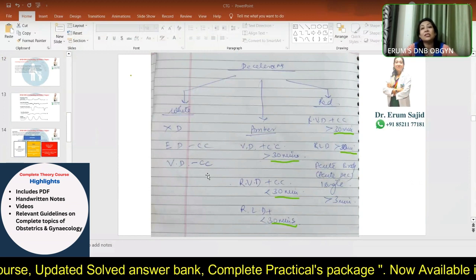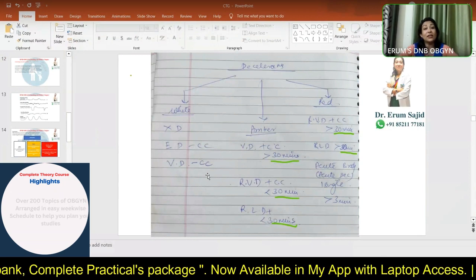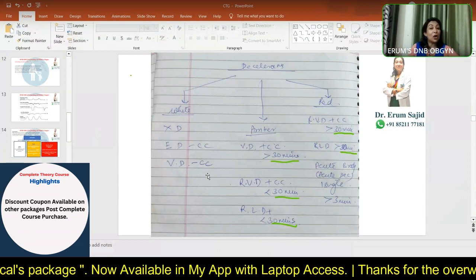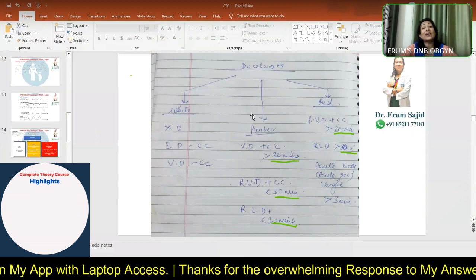Just imagine for the Indian scenario, for us, it's a very difficult situation to carry on. Continuously she's having variable deceleration, and they're not having any concerning characteristics. We are still sitting. Now, amber. What exactly is amber?